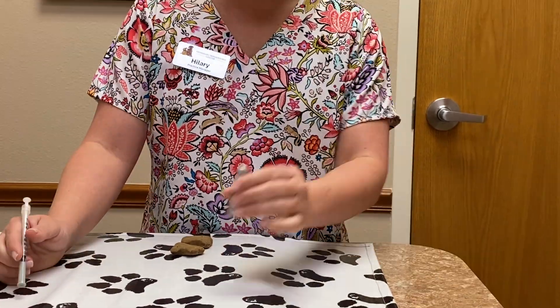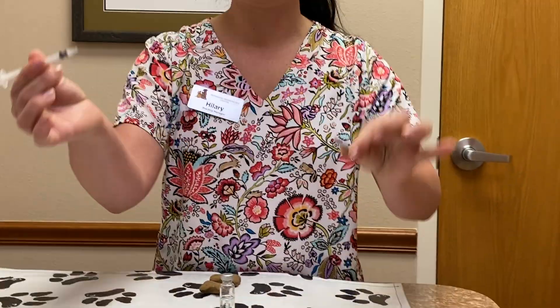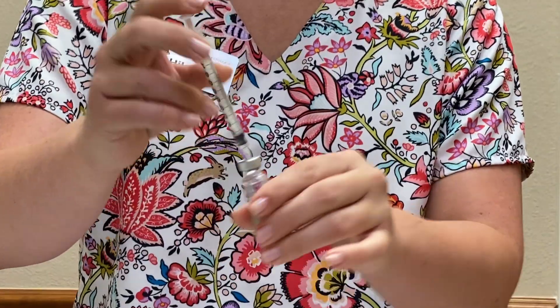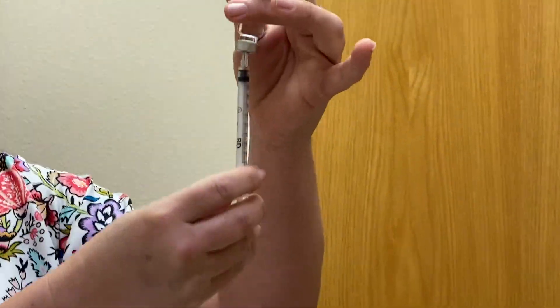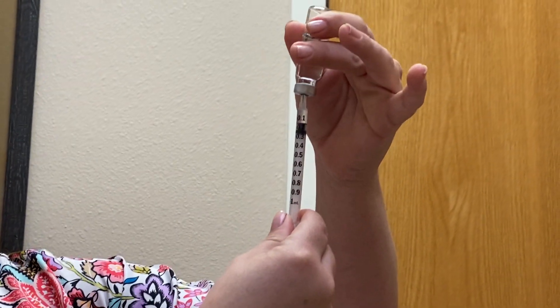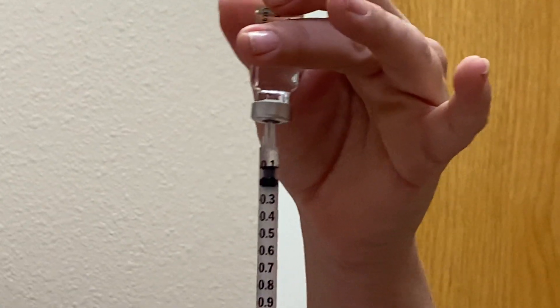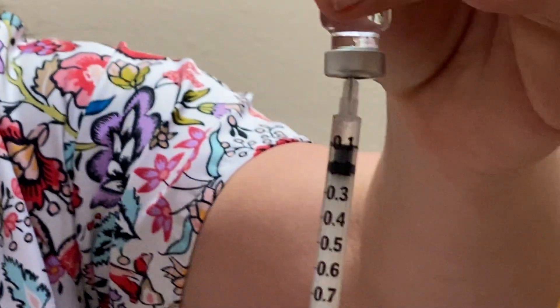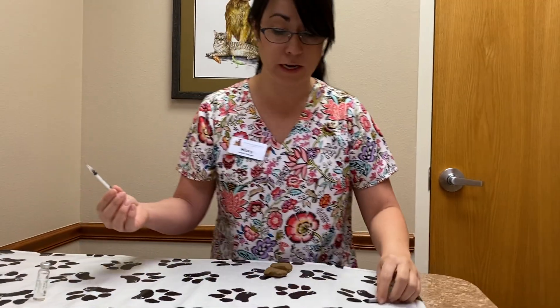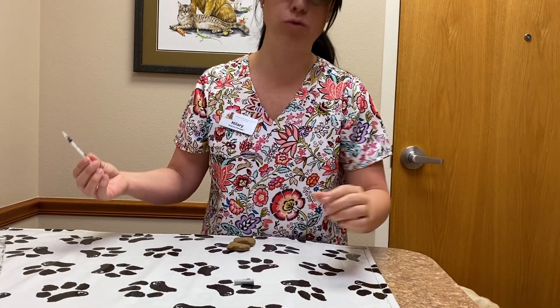To draw it up, you're going to take the lid off the needle, stick it in the top of the rubber vial, and turn it upside down. I like to overdraw and then push it back up to where I actually want to be. For example, this is 0.1 milliliters on your syringe. While you're waiting to give the vaccine, if you'd like to recap your needle, use the single-handed method.